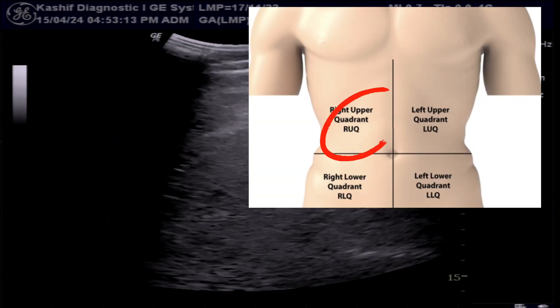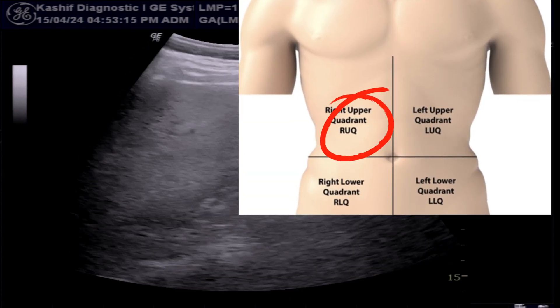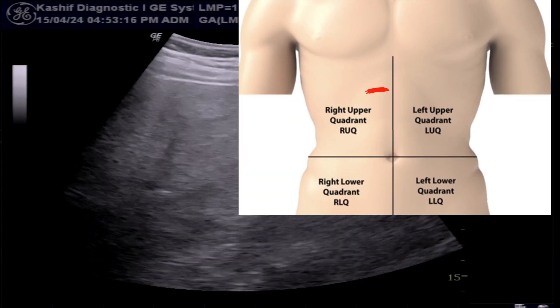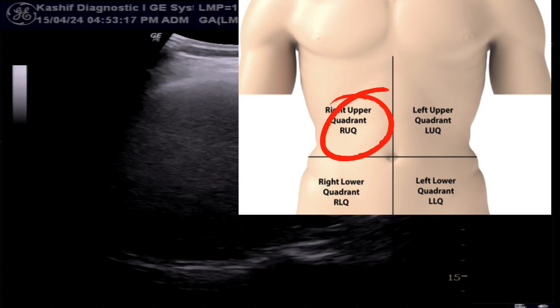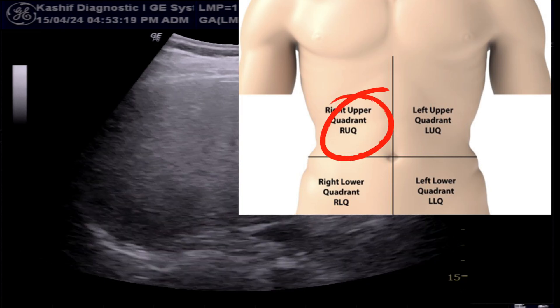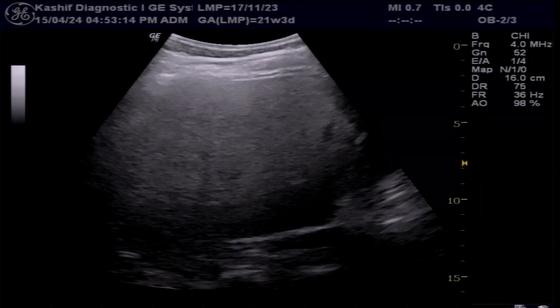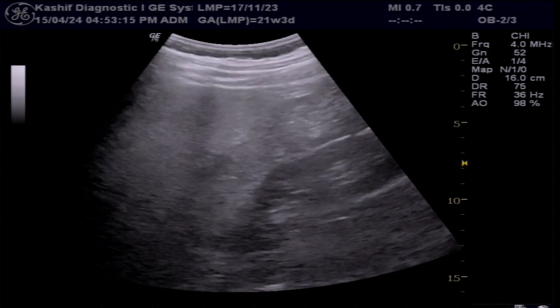This is a female patient of 40 years of age with severe pain in the right upper quadrant and fever. This is an abdominal ultrasound.